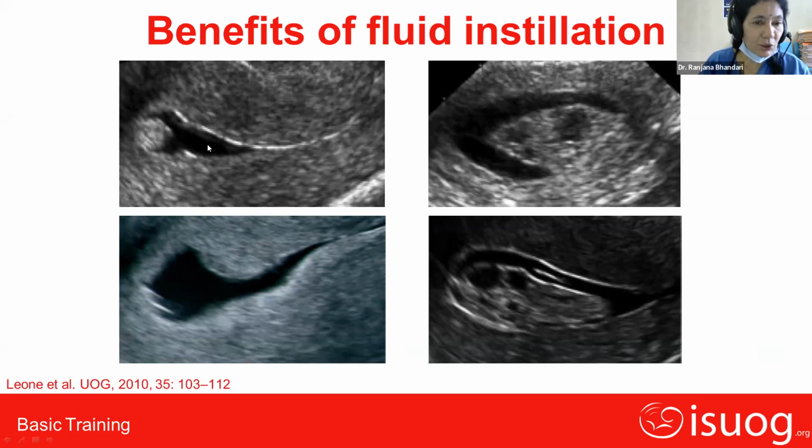In that case, we should do it in the proliferative phase, because in the secretory phase, we should always think it may be a case of pregnancy. So the balloon will be over here and the saline will be infused here. See, we are seeing such nice polyps. Over here, we are seeing a sessile polyp like this. Over here, we are seeing a pedunculated polyp like this. And over here also, another polyp.